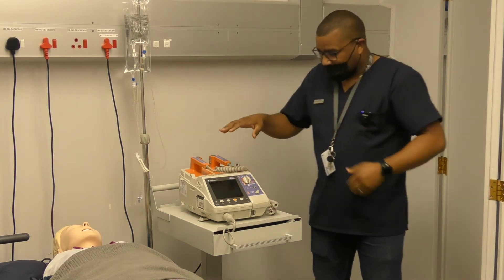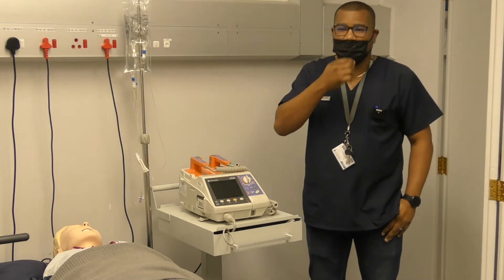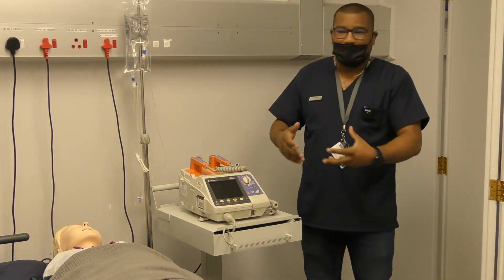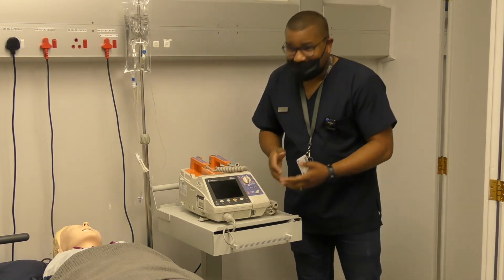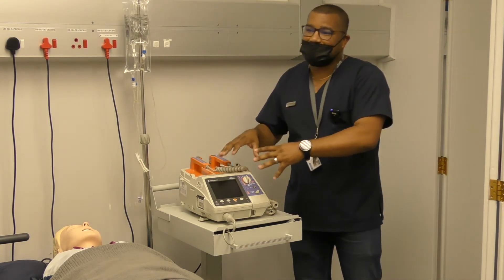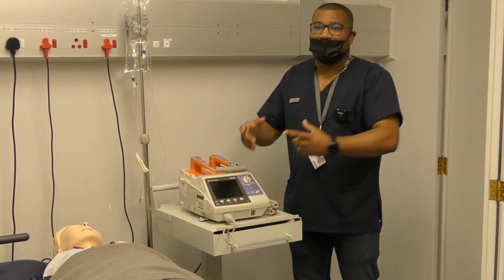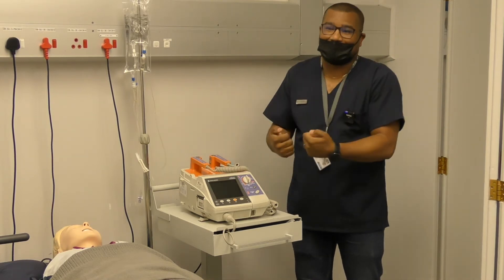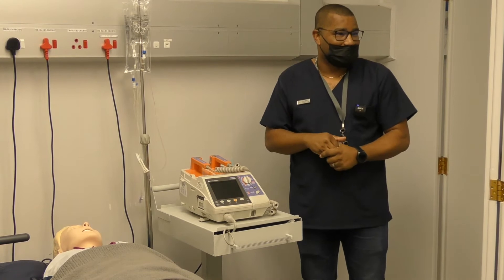At first glance, this machine has various modes — it can do more than just defibrillate. You can use it as a monitor if you just want to monitor the patient with standard vital signs. It also has an AED capability, which means it can be used by laypersons. Then there's the manual defibrillator mode where you need to be more advanced, because in manual mode you decide whether something is shockable. When you use AED mode, the AED decides what is shockable or not.